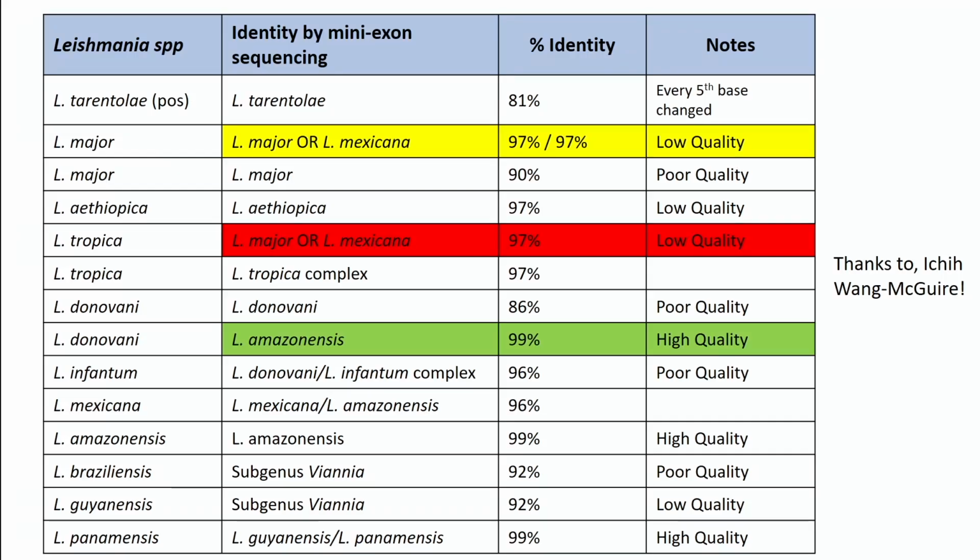So the first is that we just picked a one-size-fits-all dilution for these, and so I think we wound up both over and under diluting them, which explains a lot of the poor sequence quality that we see, and some of the misidentifications, but mostly we're able to do a good job identifying. So let's just walk through this briefly.